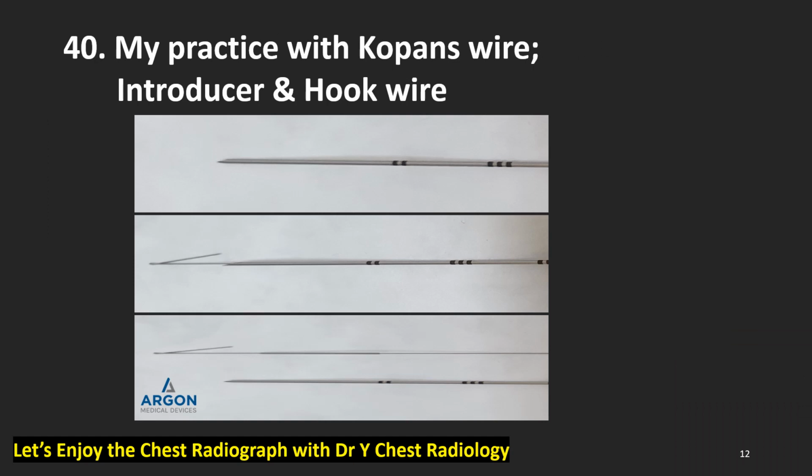Now I tell you how I do my work with these needles. This is the introducer, and inside this needle there is a hook wire. I introduce this needle tip, introducer tip, as near to the small tiny nodule of my target, not exactly to the target, not possible, not necessary, just around the nodule, near the nodule, and then slightly push the hook wire a little more.